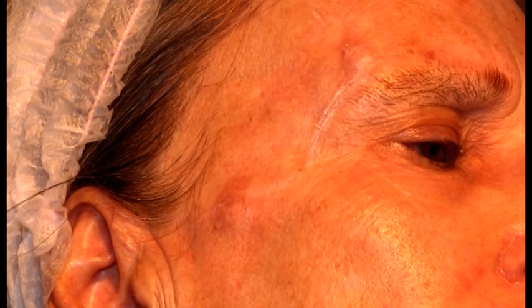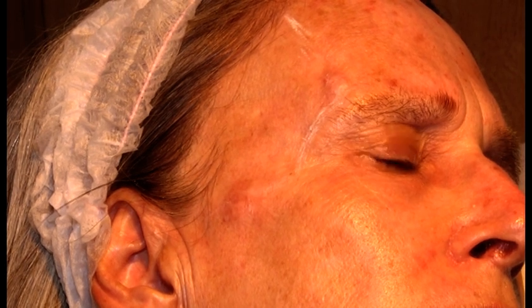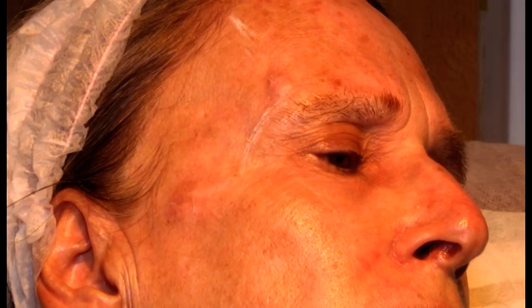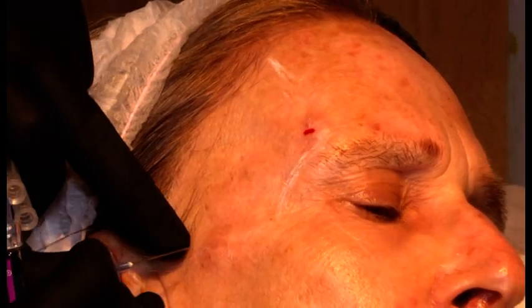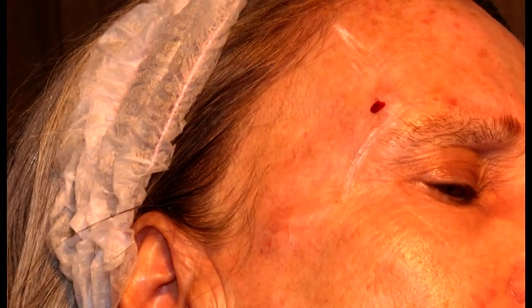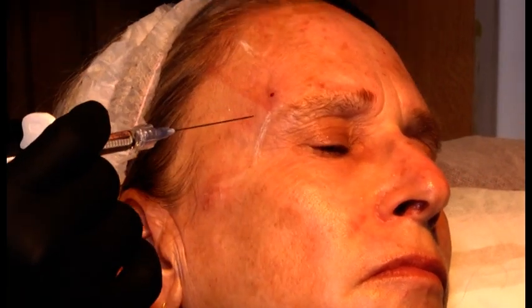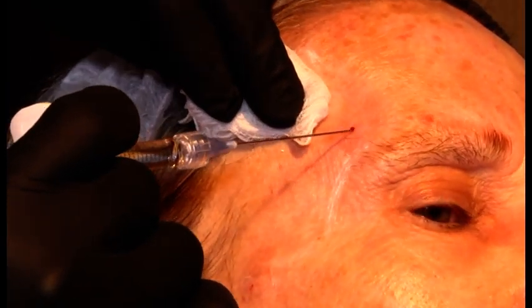Now, I will take Belotero Volume for the temple, and I will use a 23 gauge 5 centimeter cannula. These are, let's see, soft fill cannulas. I'll make a pre-hole over here and a pre-hole over here. So I will start with the frontal entry point. So here's my entry point.